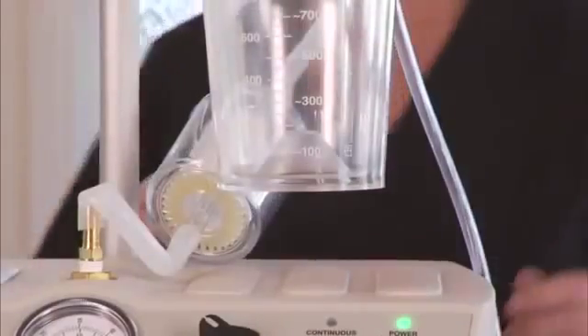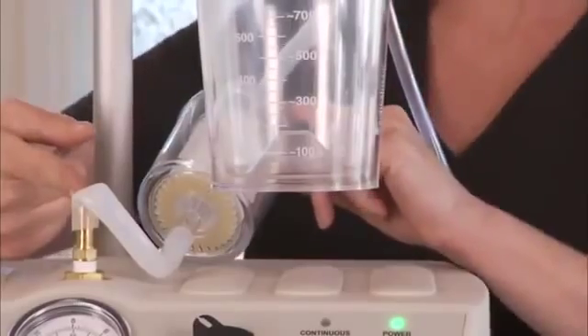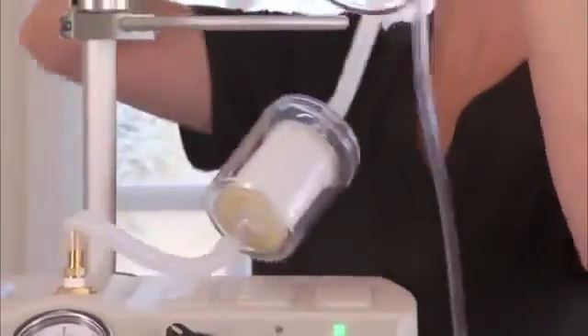Check to see if any of the tubing is blocked or if any of the tubing is kinked. If kinked or blocked, make any necessary adjustments.